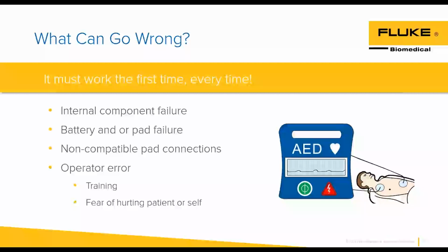Think about this. What do we use to clean our devices? Cavi wipes, caustic chemicals, cleaning solutions, Clorox. All those things could deteriorate the outside casings of these defibs. They could have long-lasting consequences. So please, when you're doing these things, take the time and make sure that we're going through the defibs and through the PMs, because we want to make sure this device works the first time, every time. While some people might only do a visual inspection, make sure it's a good, thorough visual inspection of that AED. We mentioned battery and or pad failures here.